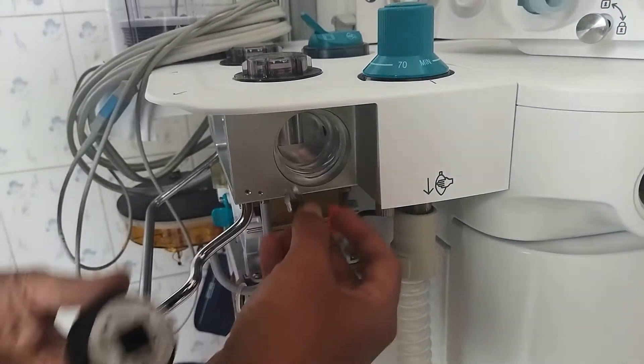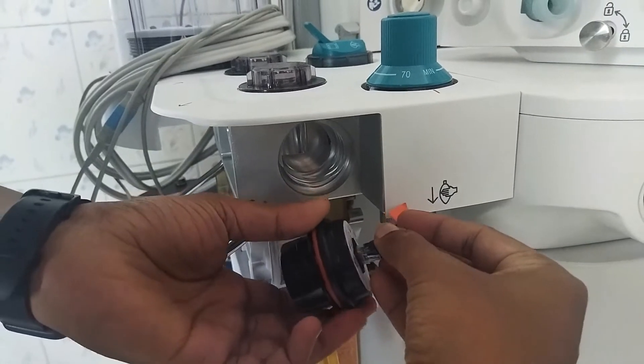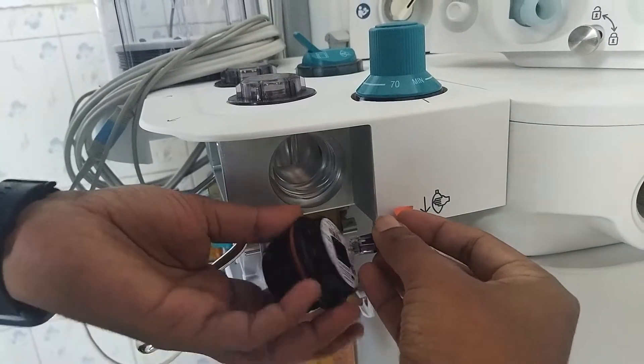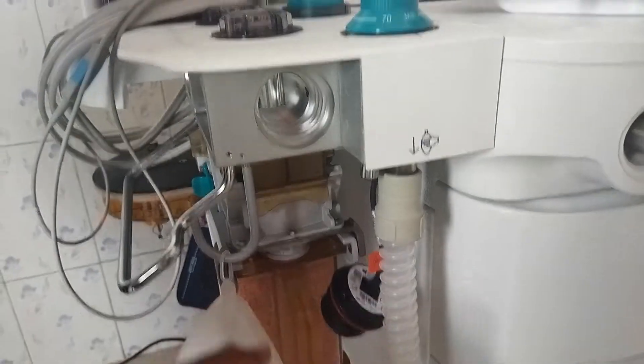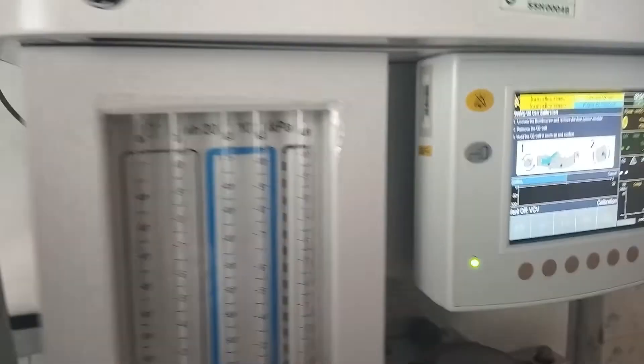Then you connect it. Keep it at room temperature. Then you can come back to the screen.